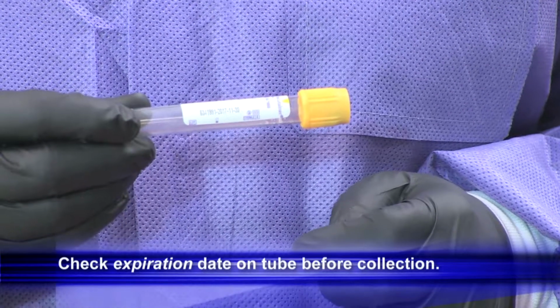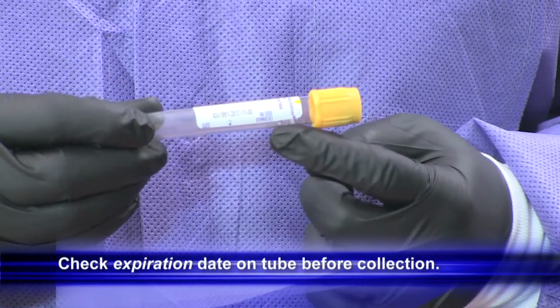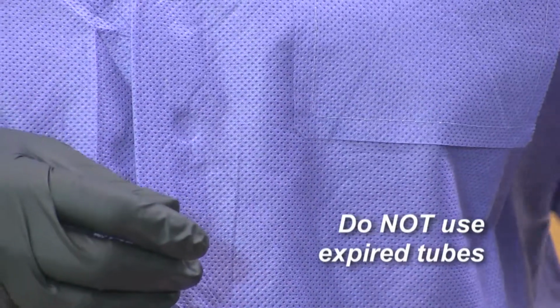Check the expiration date on the tube before collection. Make sure that the tube is not expired. Replace any expired tubes from your supplemental kit. Do not use an expired tube.